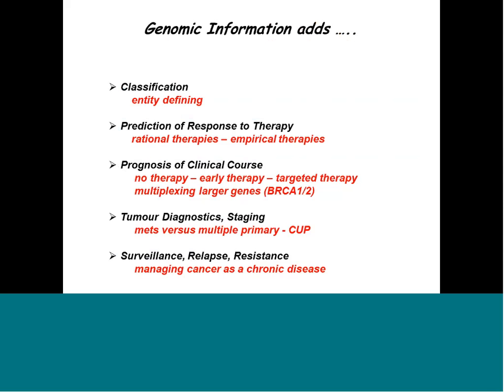In sarcomas, in many instances, the specific genomic lesions are defining the entity, also in lung cancer, as I showed you. In breast cancer, it's now applied to subclassify the types. We need these sequencing informative gene panels to predict responses to therapy, to move away from empirical therapies, to find out and predict who will be a good patient for the correct drug.